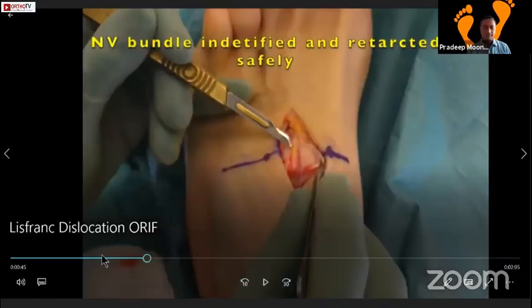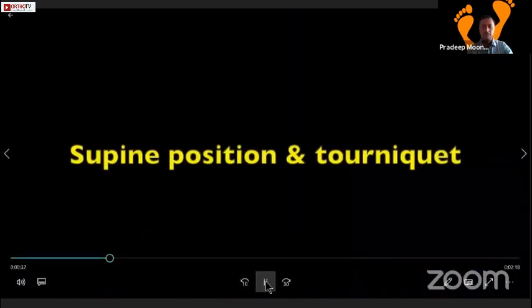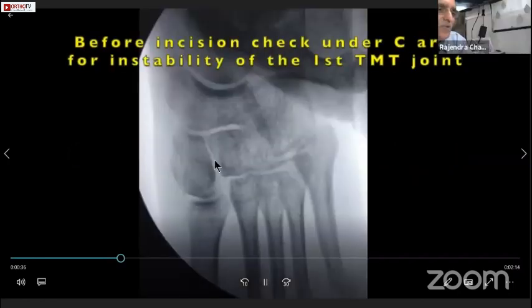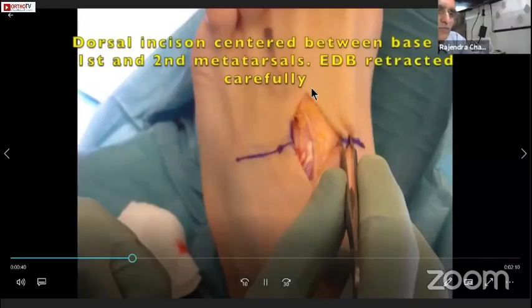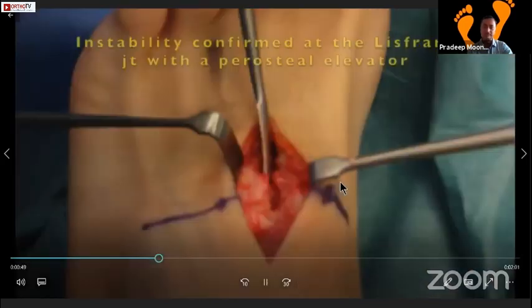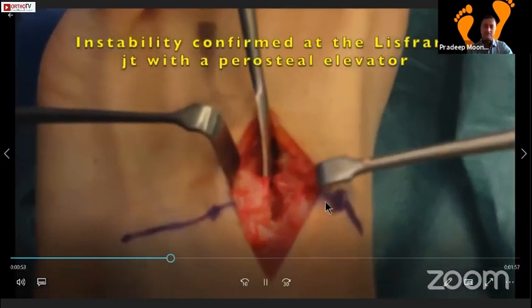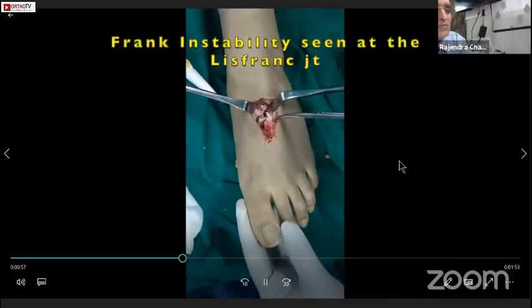So there we have opened it up - patient is in the supine position. That's your EDB, and that's your neurovascular bundle which you retract laterally. That's where you put your periosteal in between the first and the second, and you can literally see the gap there - you can see the instability.